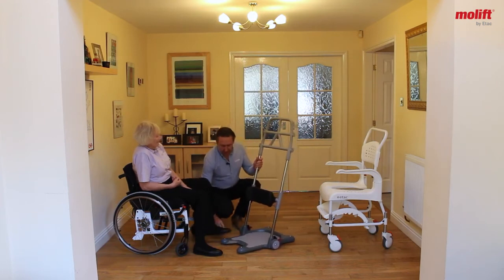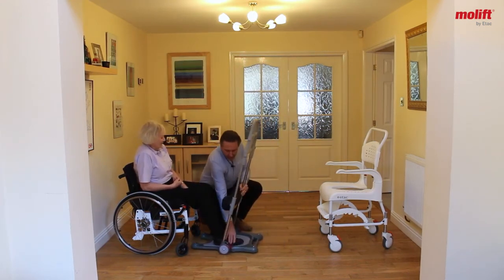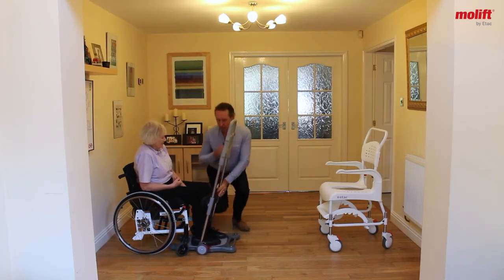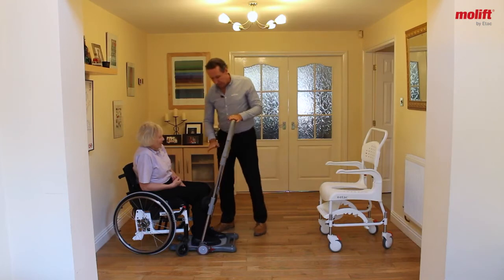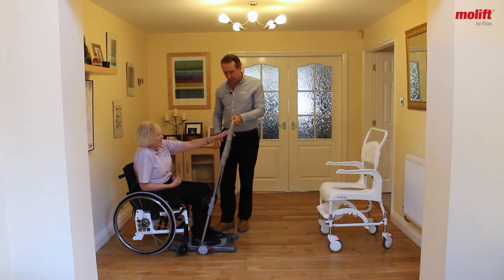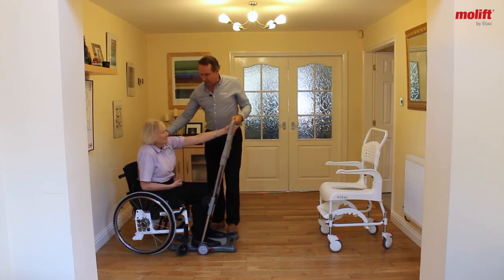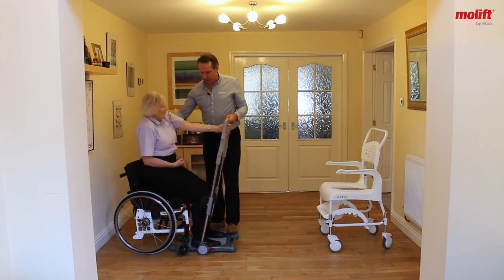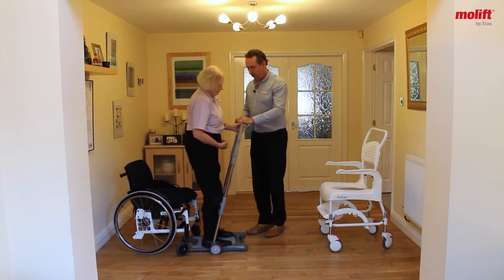If you can lift this leg up here, which is your good one, I will place the foot onto the base of that and bring the Razor in. Pop the brake on, and with the arm that you are able to use, if you can find a grip that's comfortable and just come forward in your chair, and when you're ready — ready, steady, stand. And pull yourself close to the frame, we can move you round.